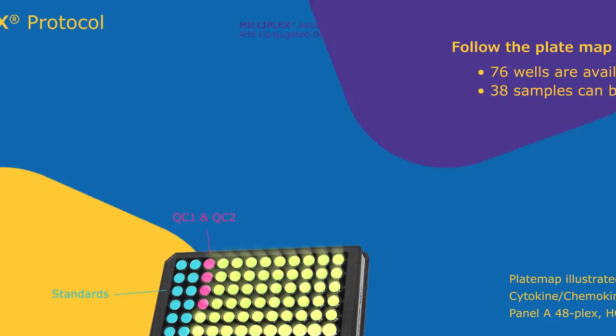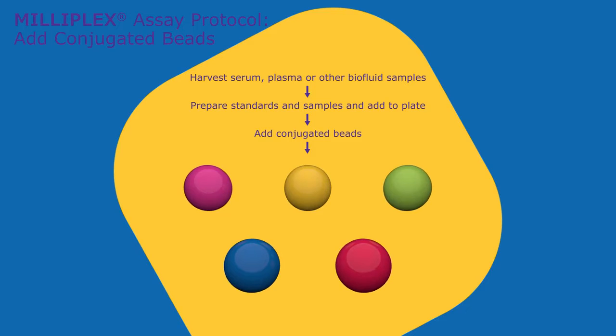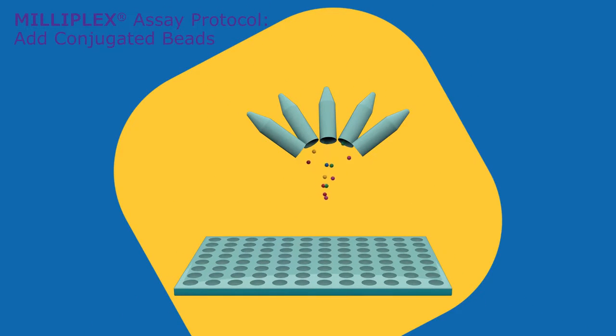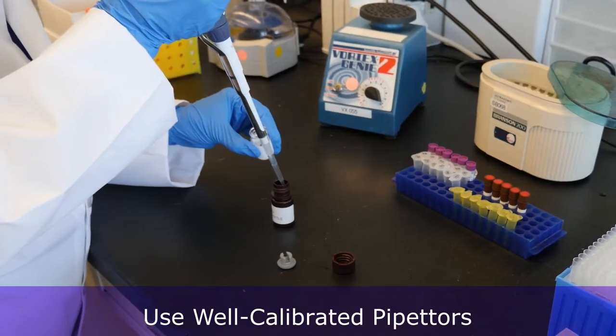Now let's highlight key steps in the protocol. Add standards and samples to plate wells, and then add conjugated Milliplex beads to all wells as indicated in the protocol. Be sure to use well-calibrated pipetters throughout the protocol.